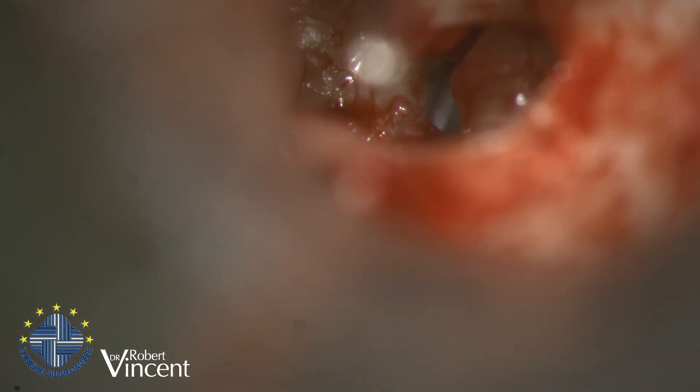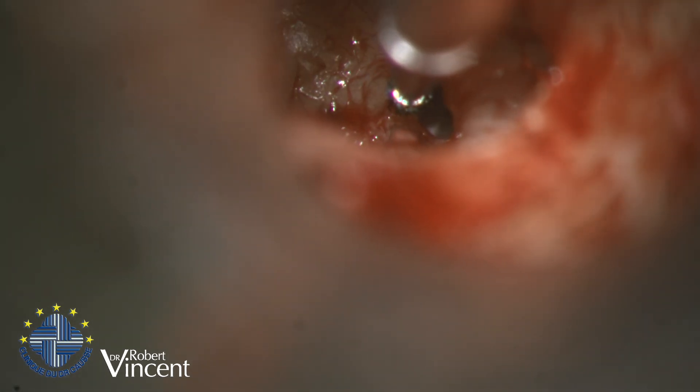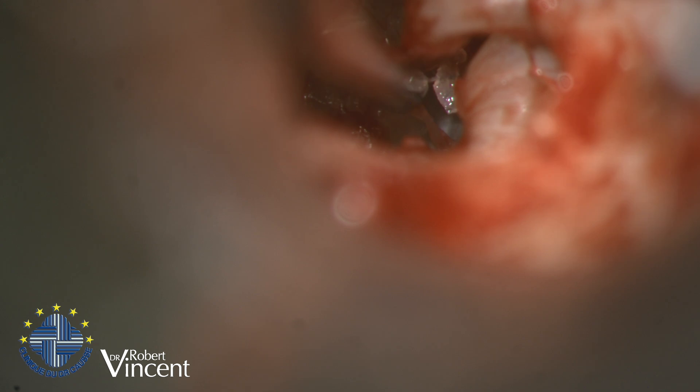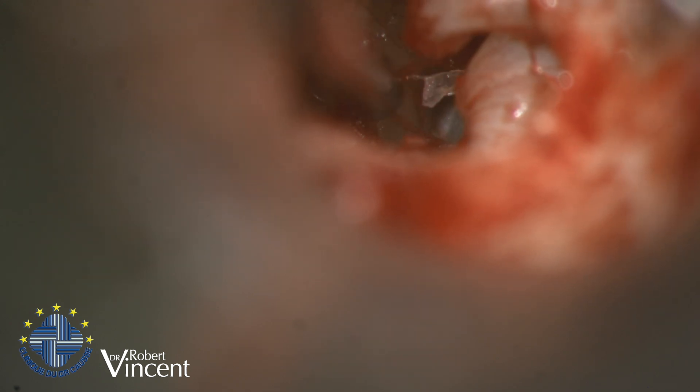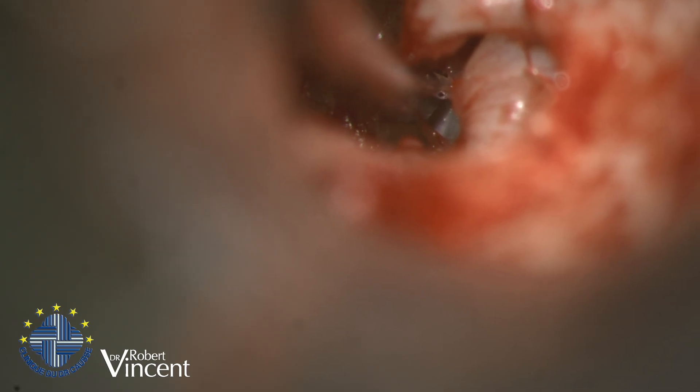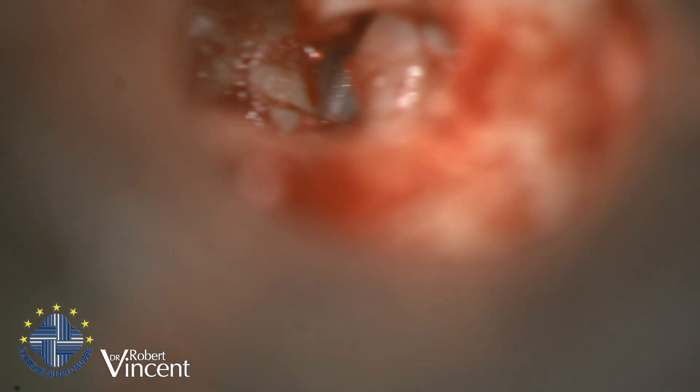Now I'm going to drill out a little bit of the promontory to have better access to the footplate, staying perpendicular to the boundary, leaving the diamond burr to do the job. I stay away from the facial nerve. There's some residual material from the crus, so again it's better to remove it — it gives us a better view. It's getting slightly better but not ideal still.